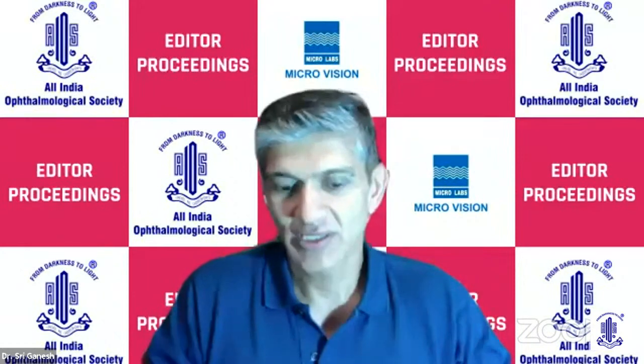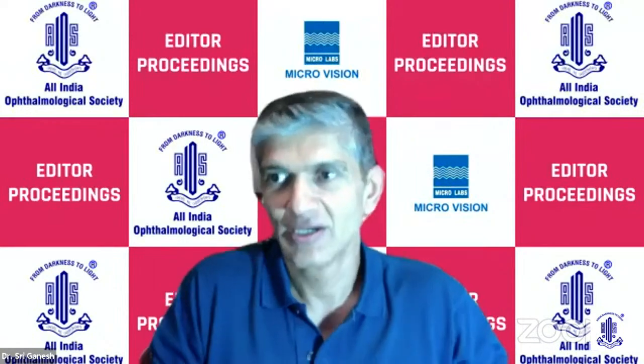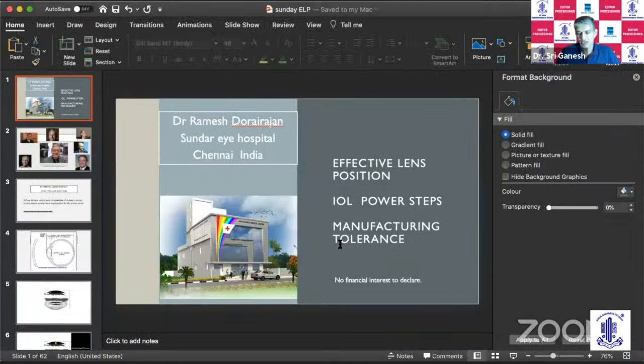One of the studies that we did looked at surgically induced astigmatism and white to white, and we presented this in APACRS Bali. It got the best poster, and I think that is one parameter which probably affects the induced surgical astigmatism. What we found is if you have a larger white to white, then the surgically induced astigmatism is less when compared to a smaller white to white, because the cord length of the incision is relatively smaller or bigger. So that is something that can also be looked at in incorporating into the formulae.